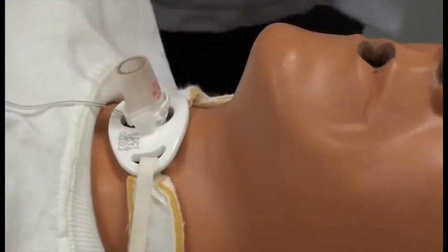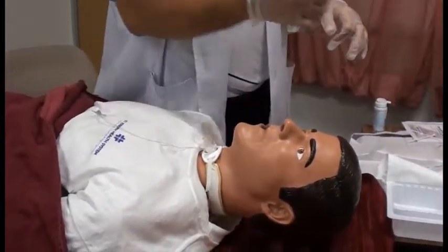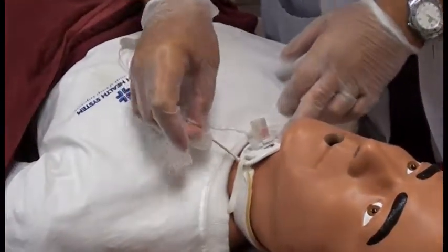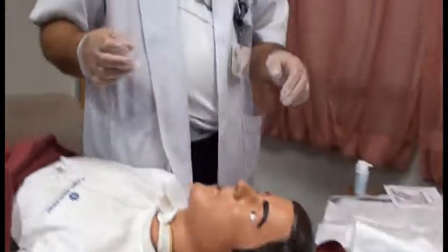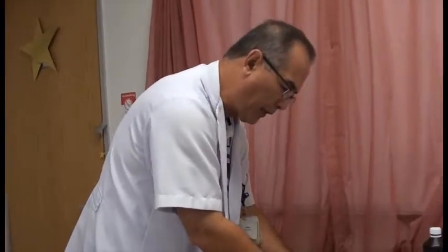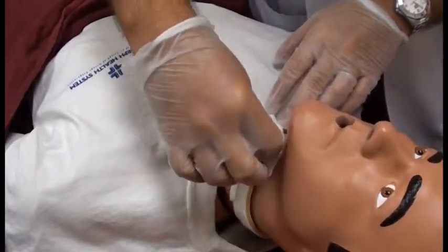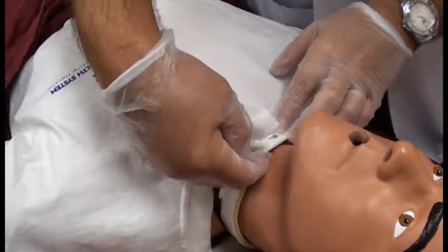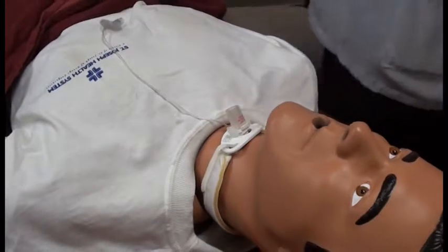After you clean it with the hydrogen peroxide, we now will rinse that with the normal saline. Again, dipping the cotton tip applicator and rinsing it off with the saline, same way we cleaned it. We want to make sure that the trach site itself is dry, and you can use the sponge that's provided for you and gently insert it inside there to make sure that we are cleaning, drying, and including the bottom part of the flange of the tracheostomy. Make sure it's dry. Okay, so we've done that.